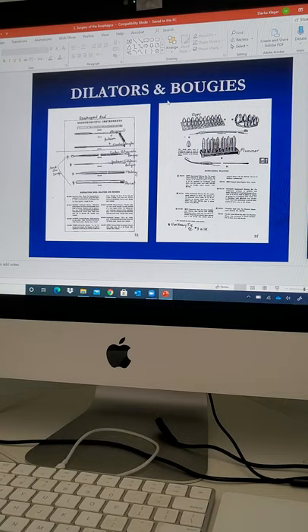Bougies are dilators, okay? They are rubbery, over here on this side, these two at the bottom. So let me see if I have that here. No. Okay, so we have the Jackson filiform, and you have it on the campus. The Jackson filiform, you remember it well because it has a square handle. So if you look at it, it's on a campus, square handle, and it has the woven tip. So this is the Jackson filiform bougie, okay?